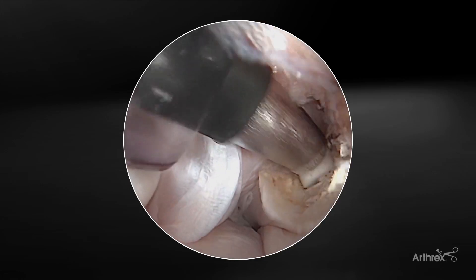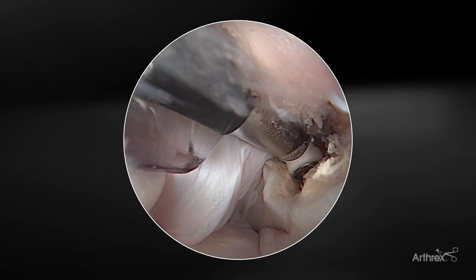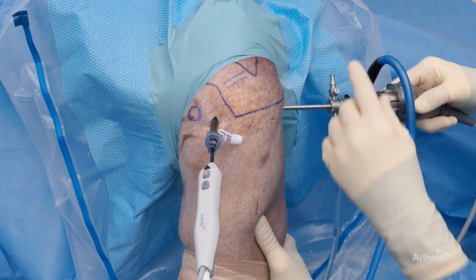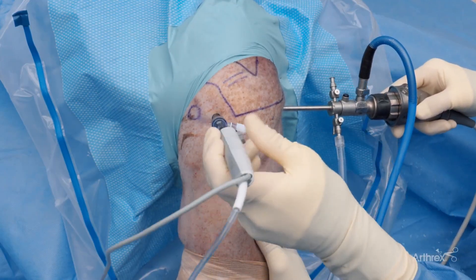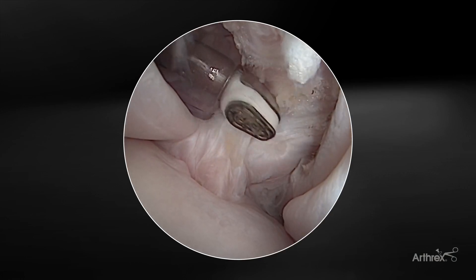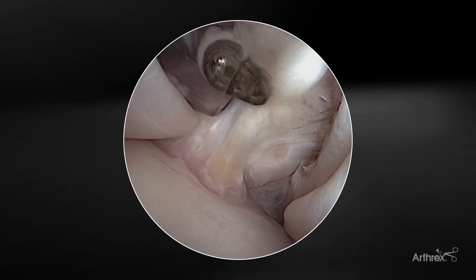As we get even more medially on the subscap, you can see how effective the i90 is at taking that MGHL for a capsule release and getting in between tight tissue planes. As you look at the lateral bicipital sling and the medial bicipital sling, if we wanted to taper that down, you can see the plasma activation affecting the tissue, taking down some of that redundant tissue.